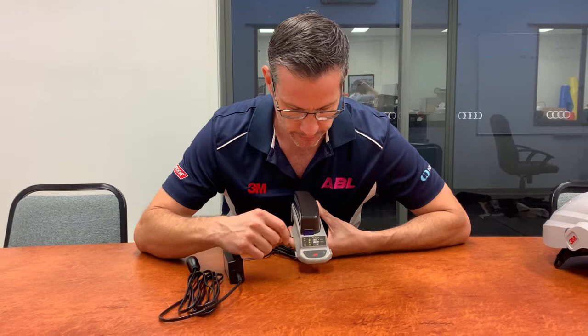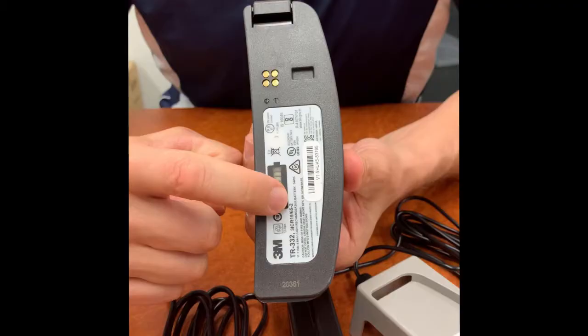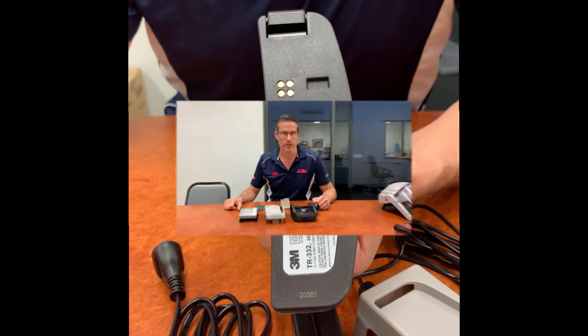Here we have two lights: orange and green. When charging, orange on and green off means the battery is dead. Orange on and green flashing means almost charged. Orange off and green on means 100% charged. One easy way to check the charge on your battery is to press the test button on the underside.